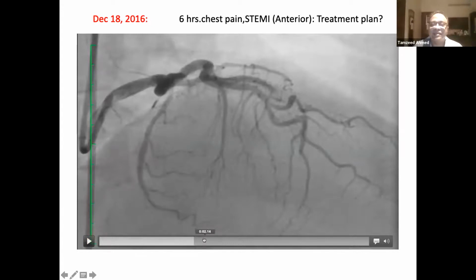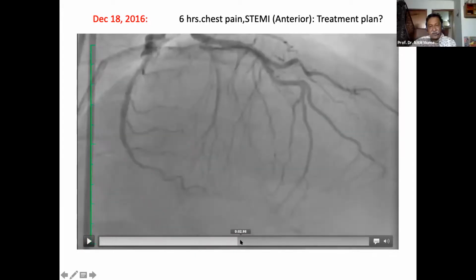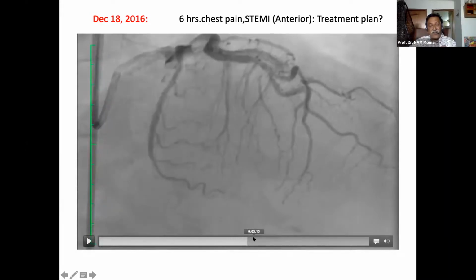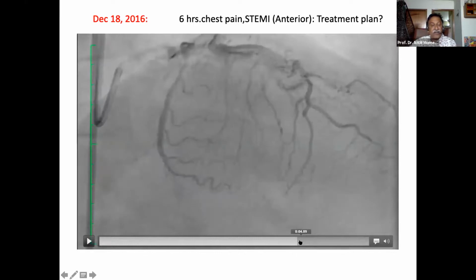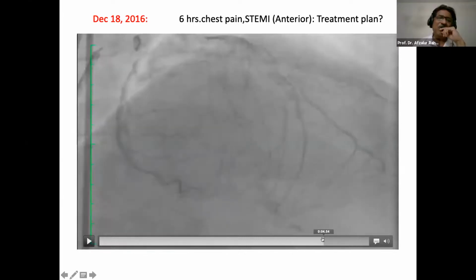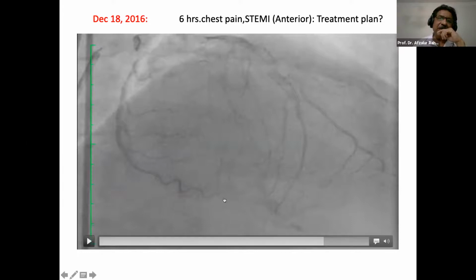Yes. Now, fracture, and some dislocation, actually. You can see that. There is a possibility of something like an aneurysm or something. No, this is a clear picture. This is a complete stent fracture. Stent fracture. You are not showing. This is not an aneurysm.